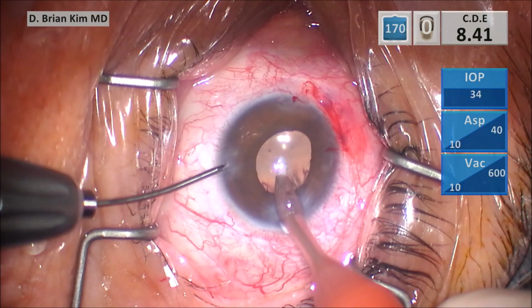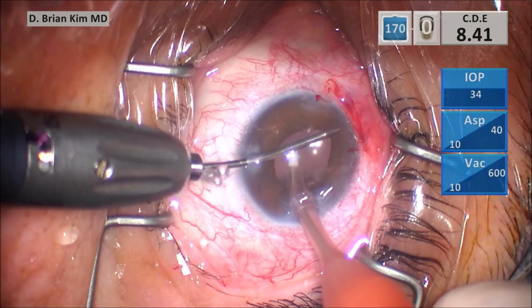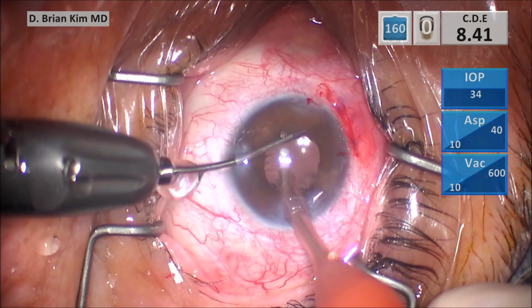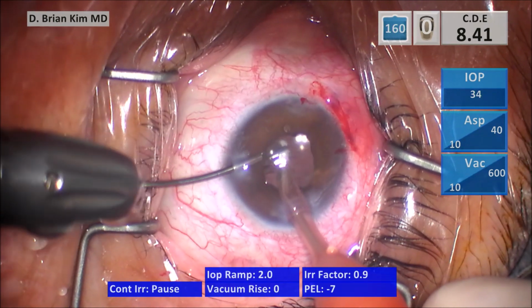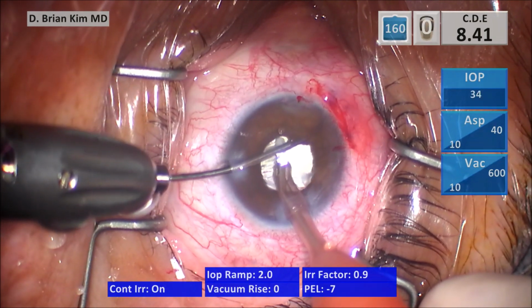And even though it only took a few passes, you saw how efficient that was. Again, not using the needle on the suture directly, but sliding that suture into a 23 gauge needle. My friend Ashvin Agarwal did suggest using a 26 gauge 1-inch needle, but I didn't have that on site. And so the smallest thing we had was 23, and it was fairly big.